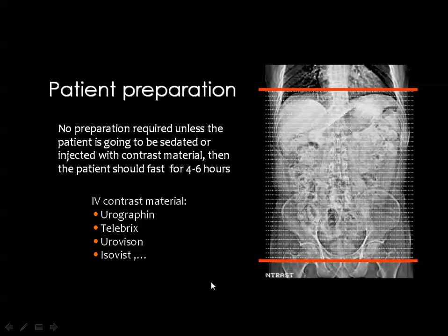And as you all know, we have two types of examination of the abdomen. The first one is the abdominal scan, which is conducted from the level of the diaphragm to the level of the iliac crest, whenever the pathology is confined to the liver, the spleen, or the pancreas. The other exam, which is CT of the body, will include also the pelvis in cases where the indications are not specific, or the lesion is not reliably localized in a certain area, like diffuse abdominal pain, searching for lymphadenopathy, and searching for abdominal metastatic deposits.